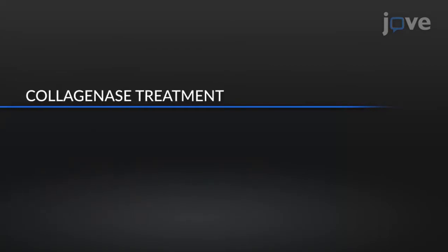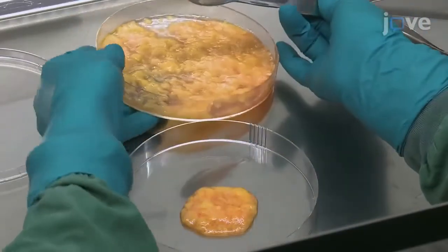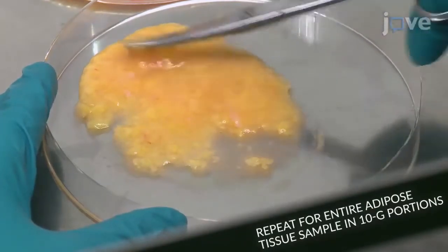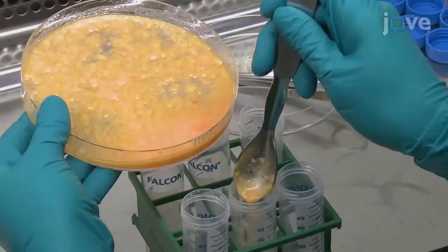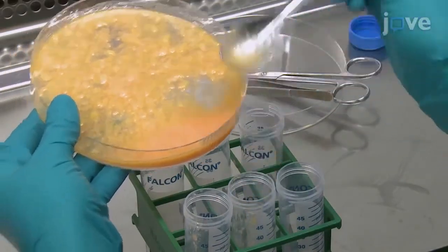To further release the cells from the fat tissue, transfer 10 grams of adipose tissue into a new 15 cm petri dish and use curved scissors to carefully mince the fat until it becomes a smooth homogenous mixture with no large pieces of adipose. When all of the fat has been processed, use a spoon to transfer 10 ml of minced tissue into individual 50 ml tubes.